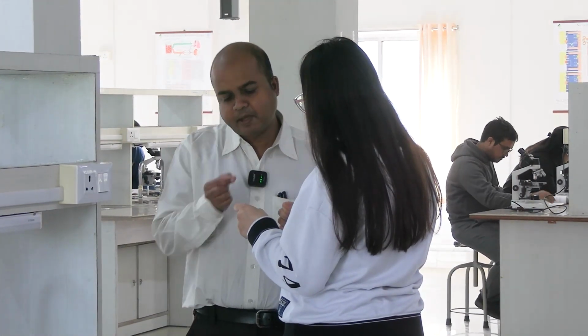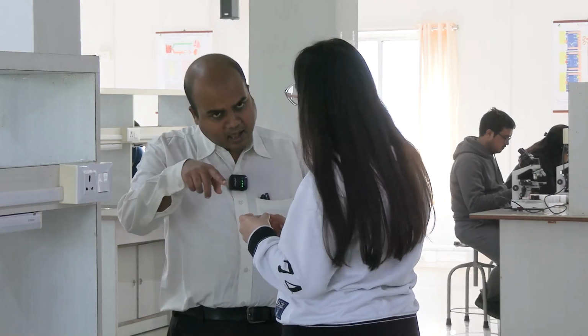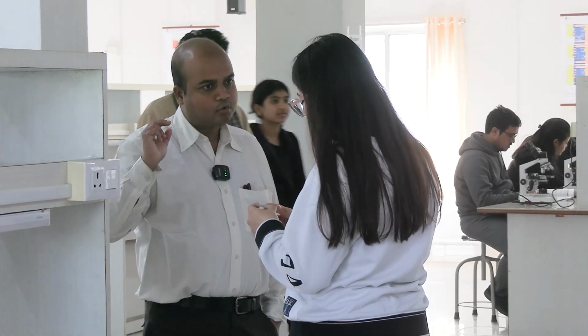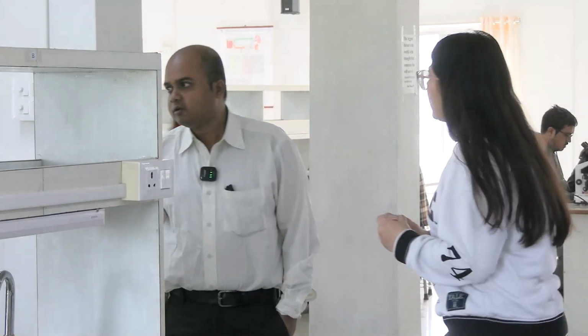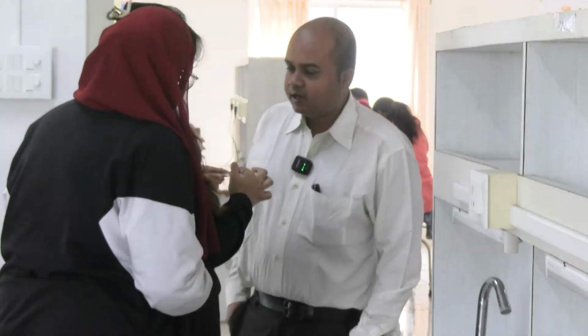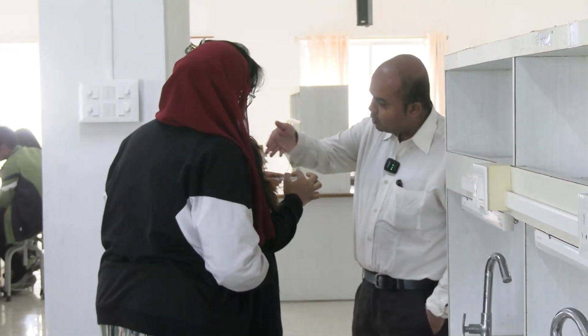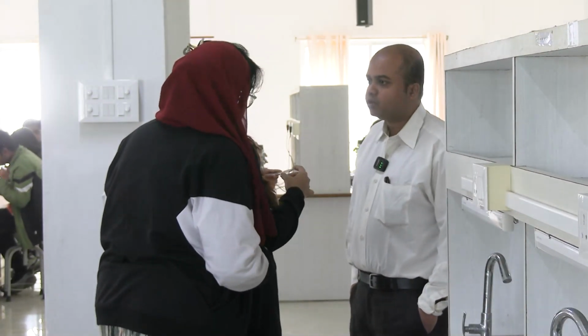After you put the cover slip, the blood has to be put under the cover slip on the Neubauer chamber, so that it is uniformly distributed on both the upper grid and the lower grid. During counting, we use any one of the grids, considering the distribution is uniform. It does not have to be done separately. When you give it, it will automatically spread to both the grids.